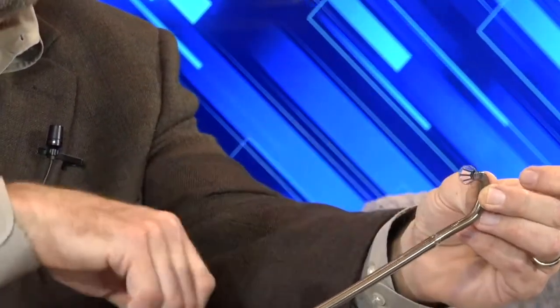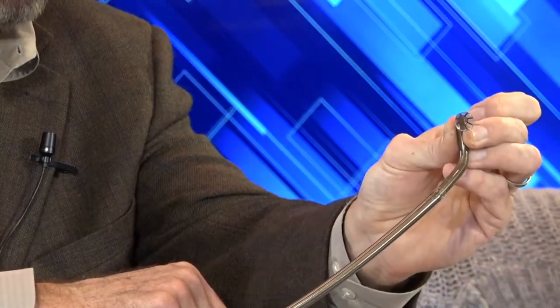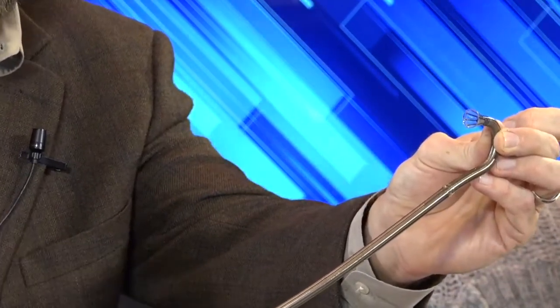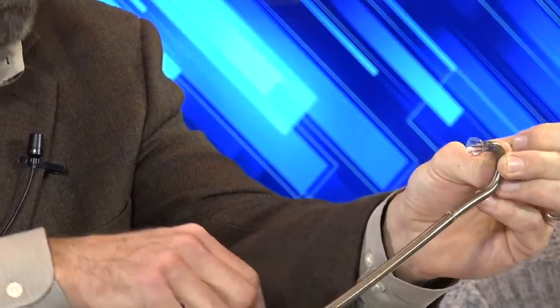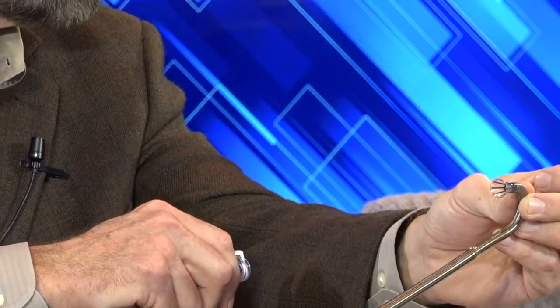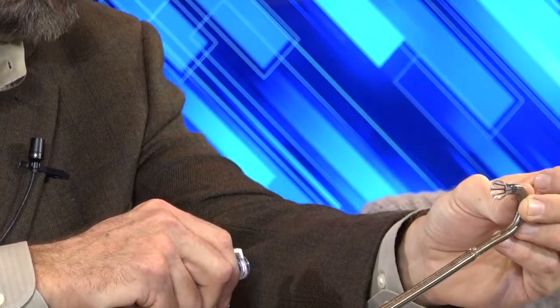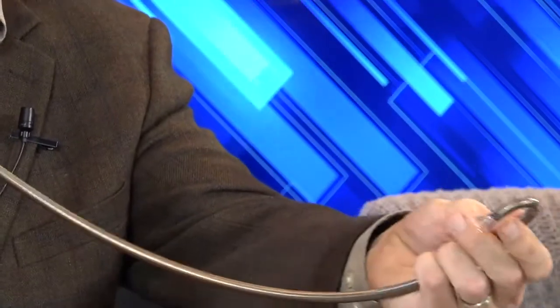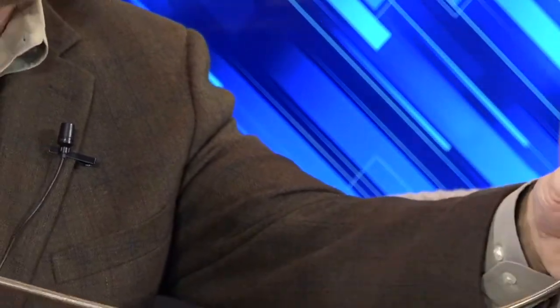Now, there is a nitinol basket on the inside of here. That funnel is the same every time, and it's 14 millimeters. And for people unfamiliar with nitinol, when it gets warm, it expands. And so as that's collapsed in the cool, you put it through the sheath, it gets in the bloodstream, and it opens up. And so the way that it's done here, instead of a balloon to expand our funnel, we actually have an oversleeve.